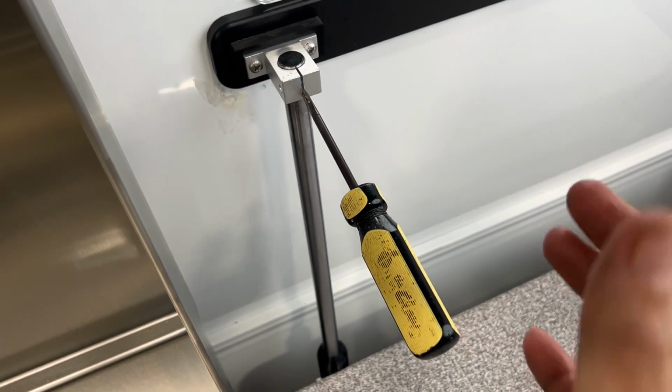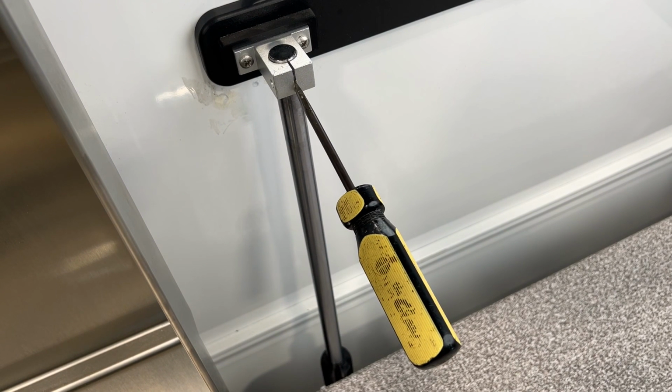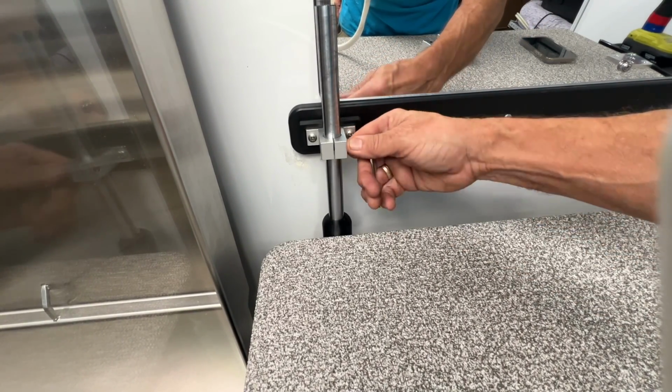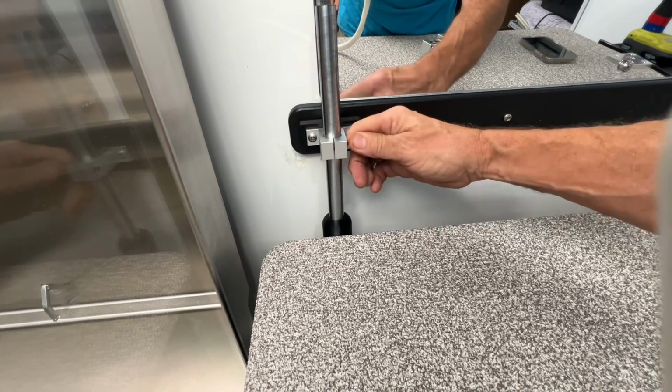If you find that the rail doesn't move well, then you may even want to push the screwdriver in just a little bit further into that joint to give you a little more looseness. And remember, leave the screwdriver in this joint until you're through moving the rail. Now that you have successfully raised the rail to give you room to add the bearings, let's go ahead and tighten the set screw so the rail can't fall as you're putting the bearings on.